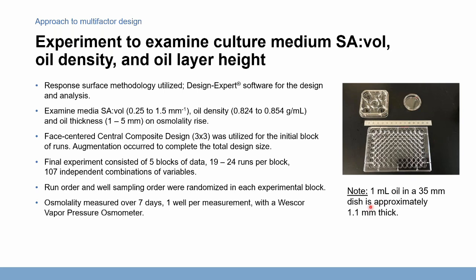One thing I will mention, and this is a huge gap in our knowledge, is that people have performed these studies, and nobody, this is unfortunate, but when you get to the end of this, you say, well, I can predict the rate of osmolality change under various scenarios. But the question is, so what does that mean as far as my embryo health? Under this scenario, we generally think less osmolality loss is better, but is there a minimum below which it doesn't matter? And nobody knows.